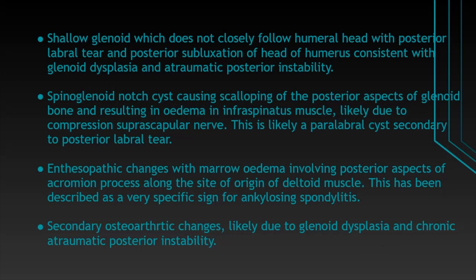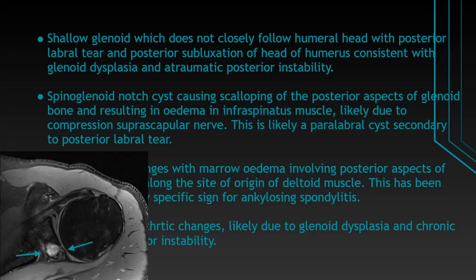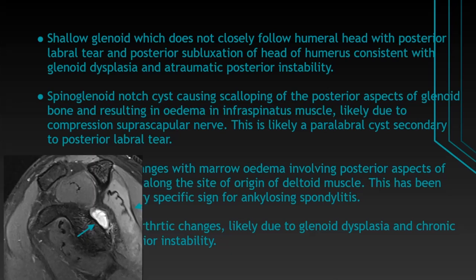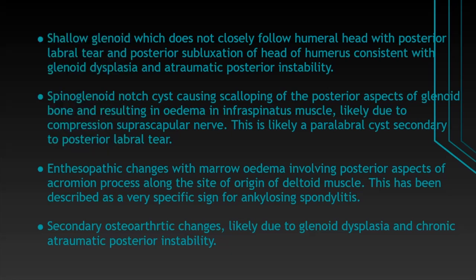To summarize, there is a shallow glenoid which does not closely follow the humeral head, with posterior labral tear and posterior subluxation of the head of humerus, consistent with glenoid dysplasia and atraumatic posterior instability, as there was no history of trauma. A spinoglenoid notch cyst is causing scalloping of the posterior aspects of the glenoid bone and resulting in edema in the infraspinatus muscle, likely due to compression of the suprascapular nerve — likely a paralabral cyst secondary to posterior labral tear. Enthesiopathic changes with marrow edema involving posterior aspects of the acromion process along the site of the original deltoid muscle has been described as a very specific sign for ankylosing spondylitis. Secondary osteoarthritic changes are likely due to glenoid dysplasia and chronic atraumatic posterior instability.